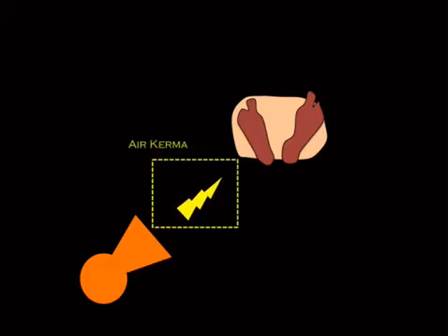So the sum of kinetic energy of all the charged particles made when an X-ray or a gamma ray passes through a unit of mass of air, that right there is an air KERMA. So when you hear the air KERMA was this or that, it's an idea for defining how much dose the patient's getting. But the physicists who developed it, we're not talking about what's going on inside the patient. This is an air KERMA. It's within a unit of air, a mass of air, the kinetic energy transferred to the charged particles. Remember, just in that first step.